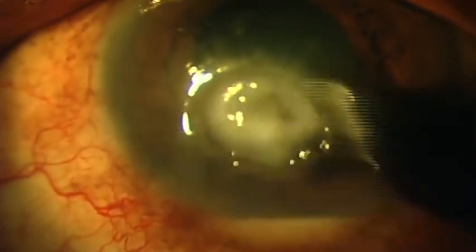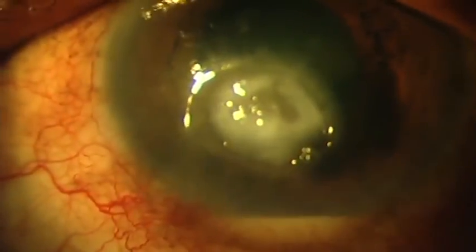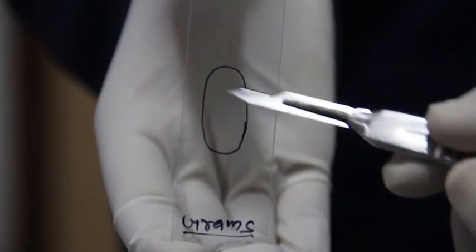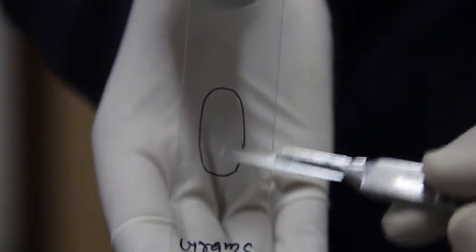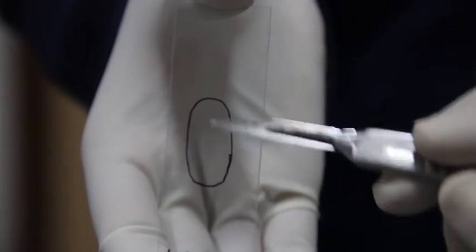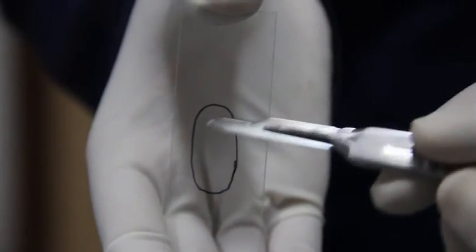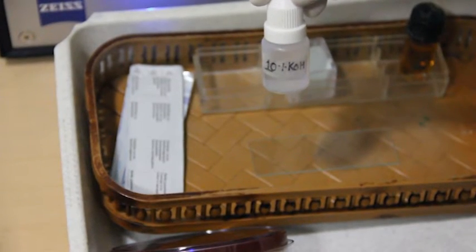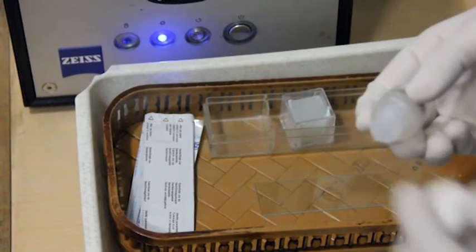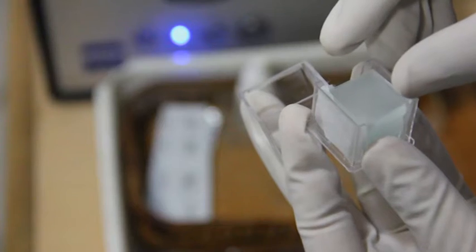All necrotic material should be removed from the ulcer surface using a sterile blade or a Kimura spatula. The scraped sample is placed on a slide, crushed, and spread to prepare a smear which is stained and examined under the microscope. The sample used for KOH mount is not crushed; instead, a drop of 10% KOH is added and covered by a coverslip.